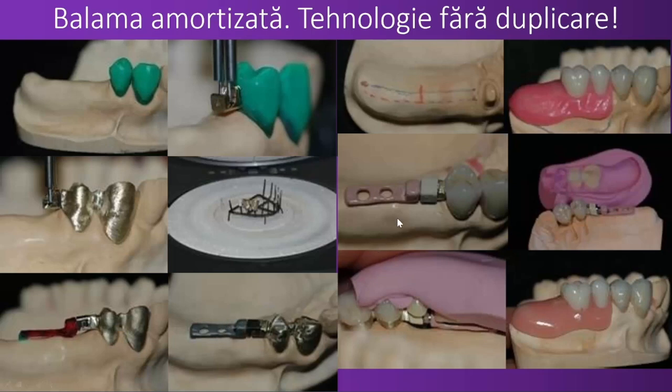It has been painted with pink. When we place the teeth from the distal part of the last tooth to the center of the piriform tuberculum, we only place into occlusion half of this space, but the saddle extends as much back because we want to have a big rest on the bone and to reduce the sinking. It can be very interesting and new.